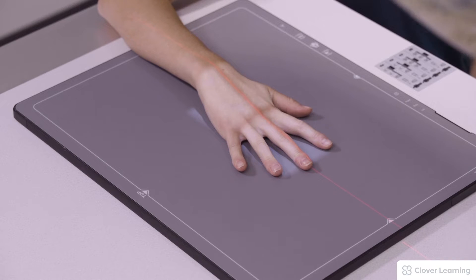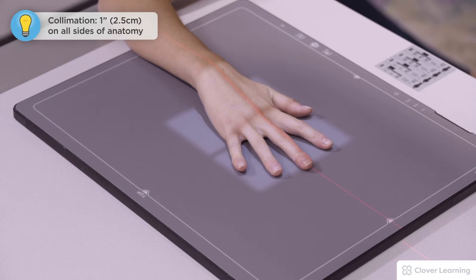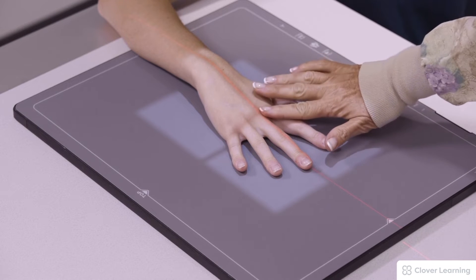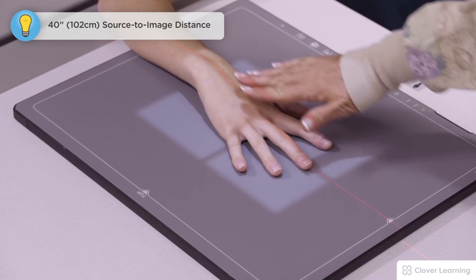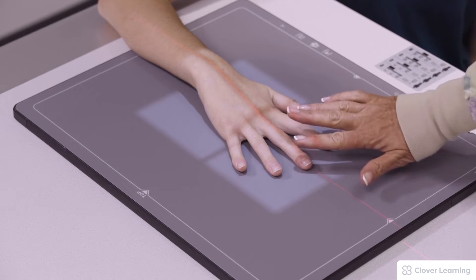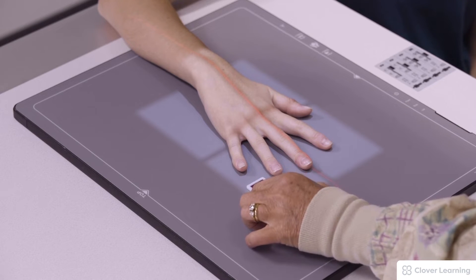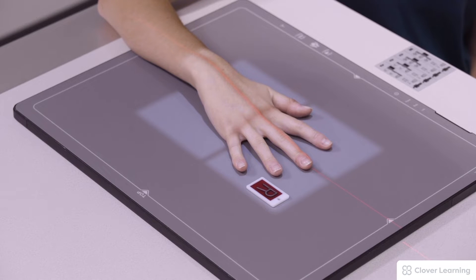We're going to collimate and open the field so we include all the anatomy. You're going to see the MCP joint, the metacarpals, the carpals, and of course all phalanges — the proximal, middle, and distal phalanx. A marker is placed within the light field and the exposure is made.